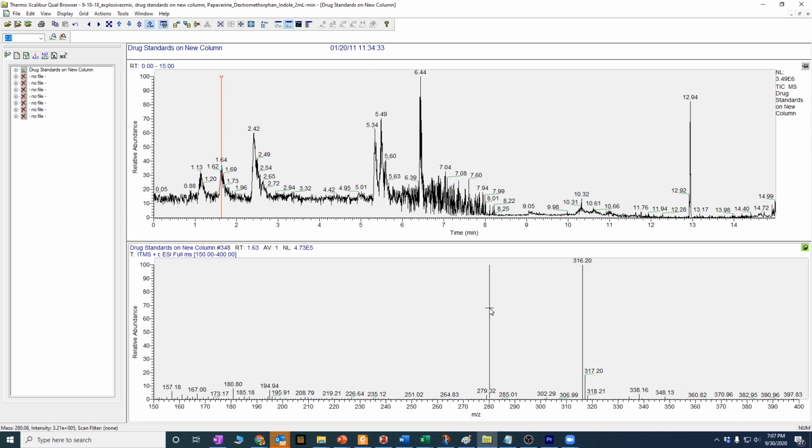This type of mass spectrometry that we're using right here, they actually sort of debate this in SWGDRUG, but the way that we have this mass spectrometer set up, it's not exactly category A. There are a lot of things it could be. It's a pretty strong category B, but just to say that something has a molecular weight of 315 certainly doesn't tell you the identity unambiguously of that compound, but it is a lot of really good information.